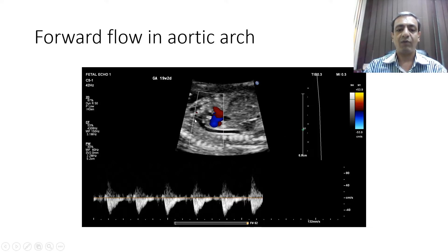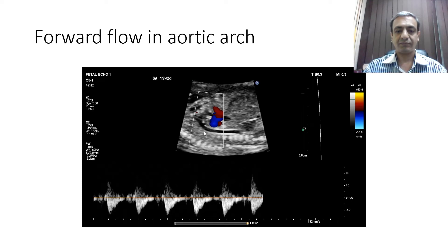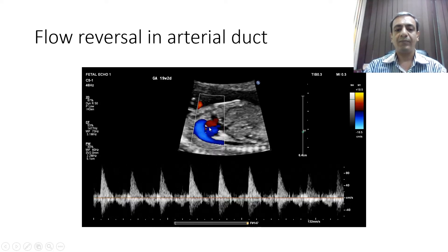This is a pulse wave Doppler image showing the forward flow in the aortic arch and the flow reversal in the arterial duct. I want to show you the change in direction of Doppler — in the aortic arch the flow is downward, away from the heart, while in the duct the flow is upward, indicating reversal.